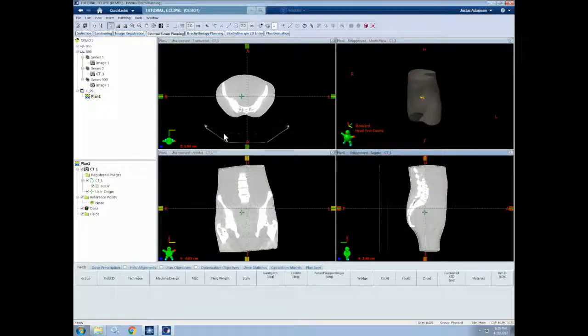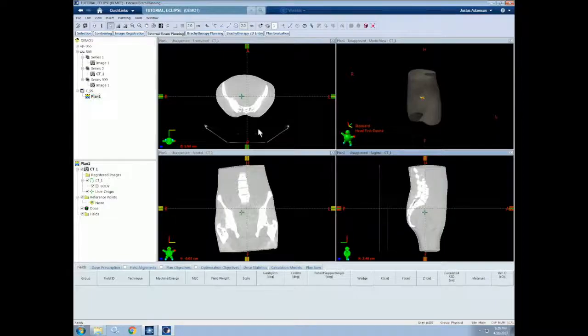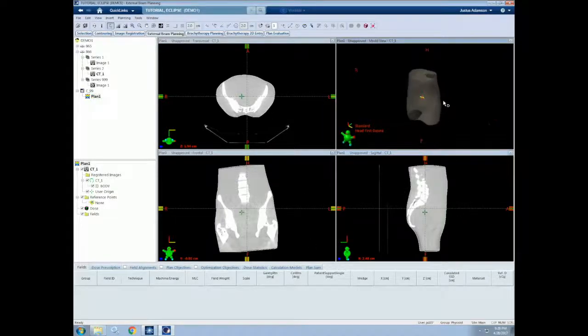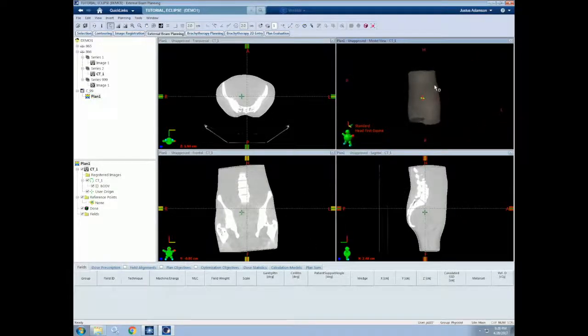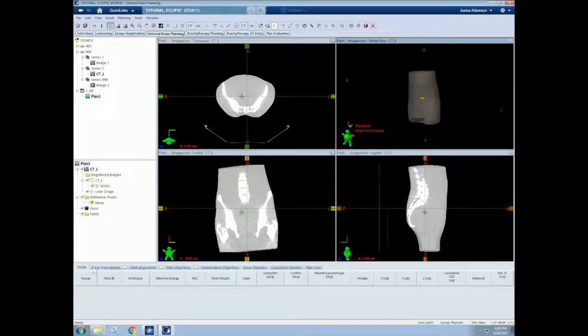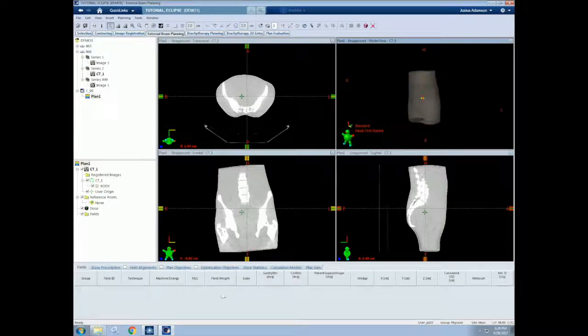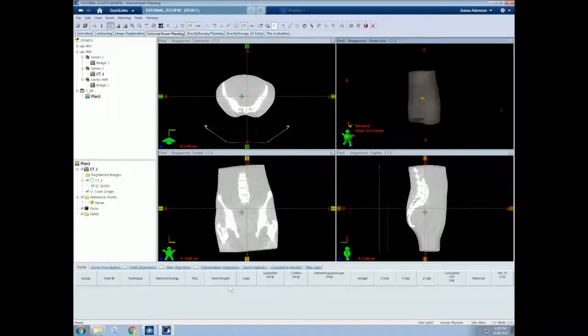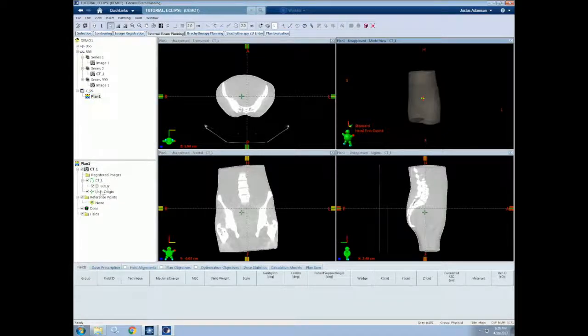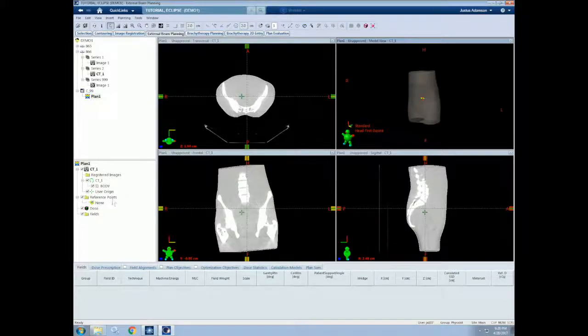As a quick reminder, we have our transverse, coronal, sagittal, and 3D views of the patient. We also have our fields and other information down here, so dose, prescription, etc. The left side shows our courses and plans on top, as well as our structures, images, dose information, and fields down below.